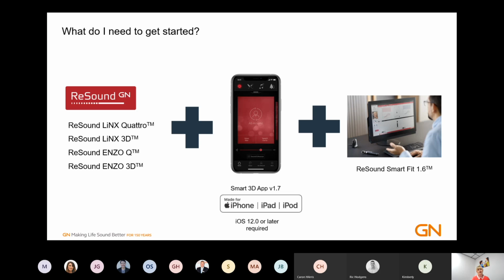The newest version is version 1.6. If you're not sure which version of the software you have, if you just hover your mouse over the Smart Fit icon in your Noah, it'll tell you what version it is.